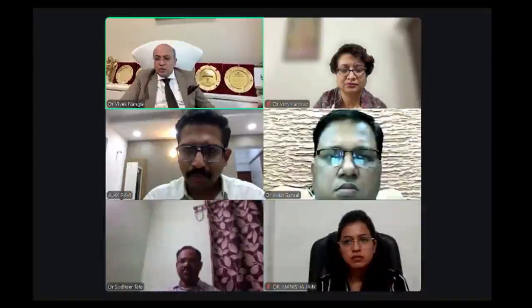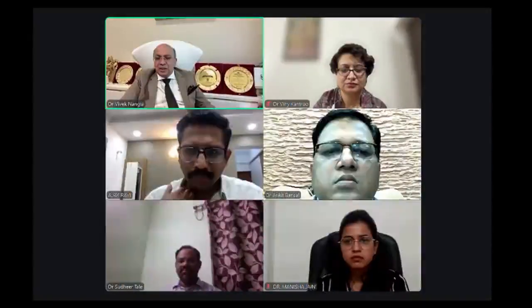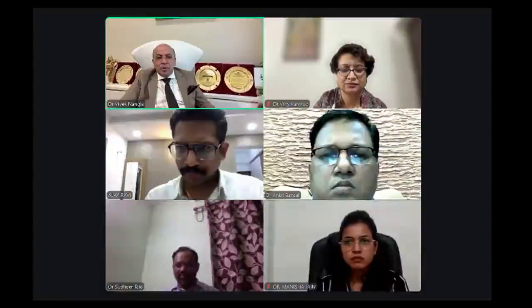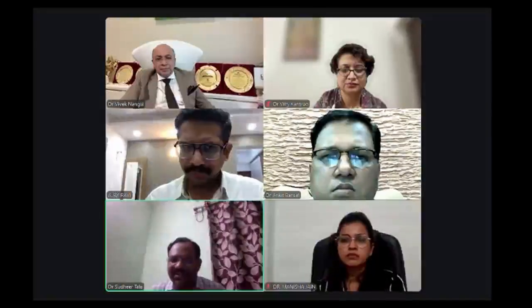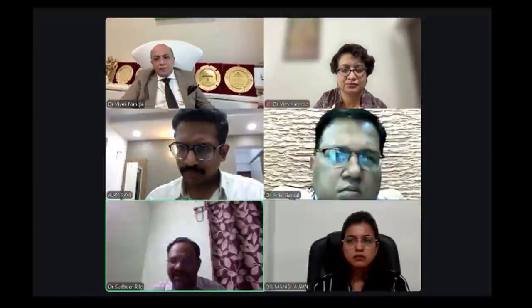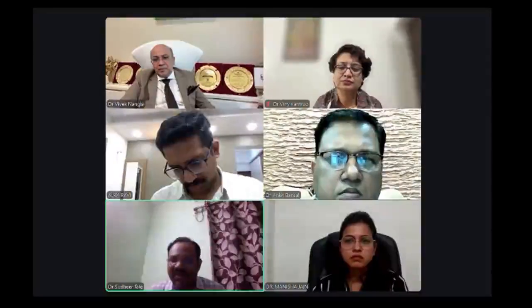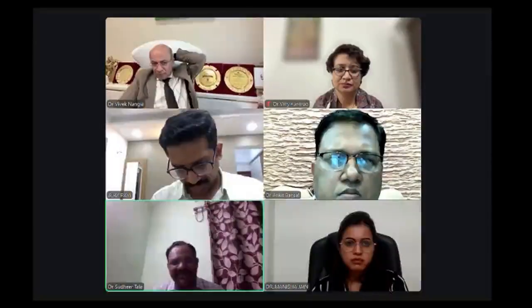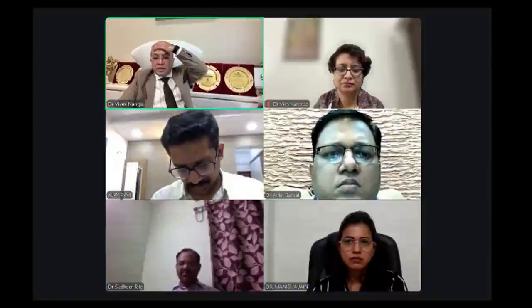Now coming on to another question from Dr. Akif from Akola. He has lots of queries. I think most of that we've touched upon already, but I guess we'll just repeat it for his benefit. Starting from Dr. Tale, what are the indications of a bronchoscopic biopsy? The main indications are to diagnose lung cancer, to know the etiology of interstitial lung diseases after we have sent every workup, and to know about the etiology of different chronic infections like tuberculosis, fungal infections, etc.